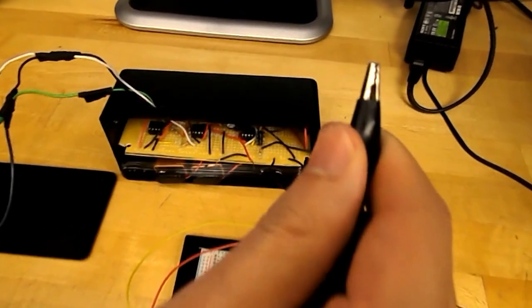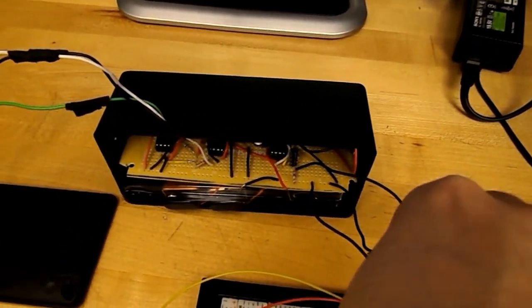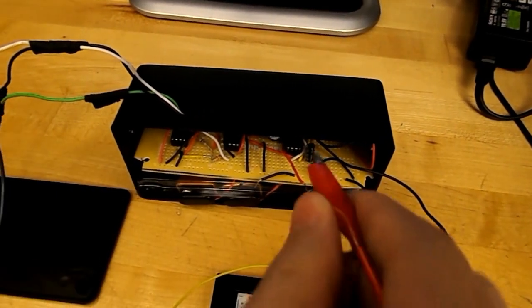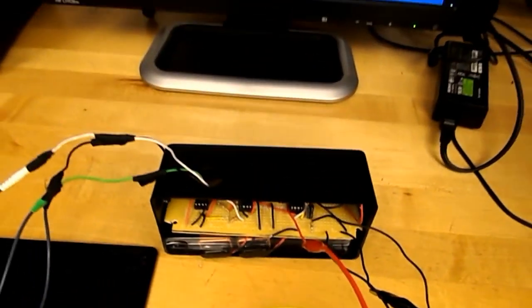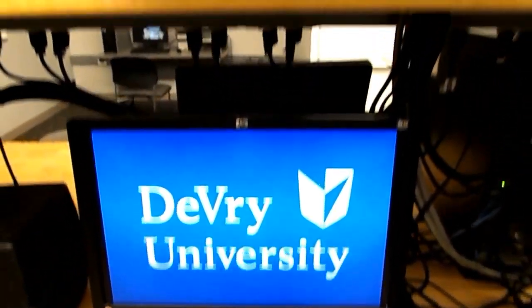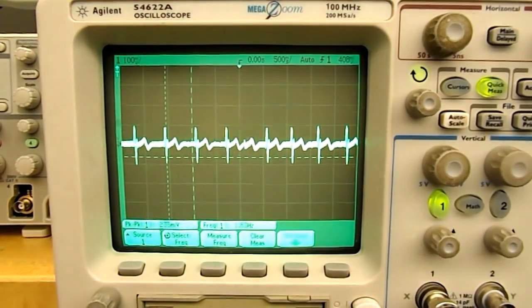Now we're going to connect this black wire from the oscilloscope to our ground on the ECG. And the red wire goes to our output of the ECG. There's our signal.